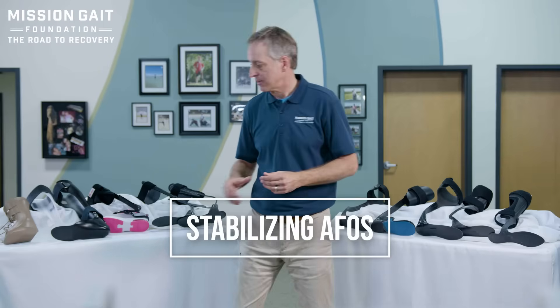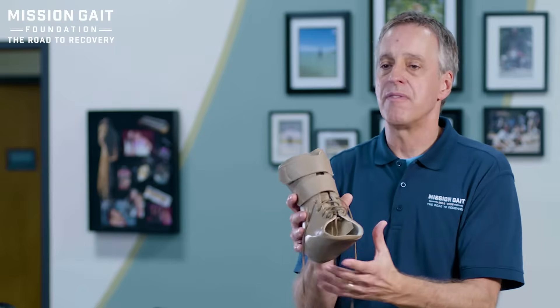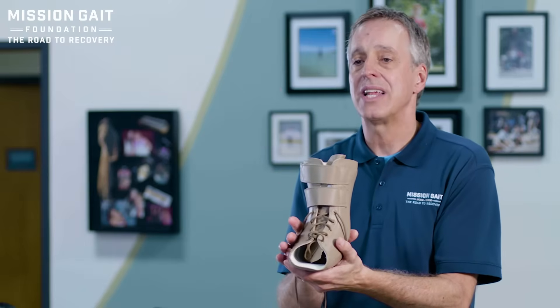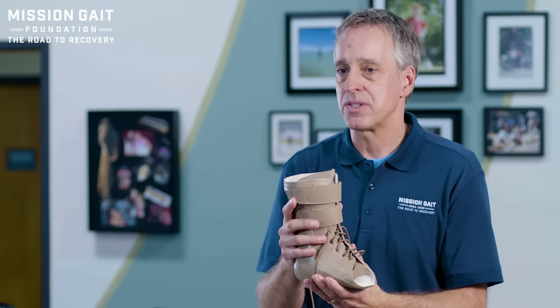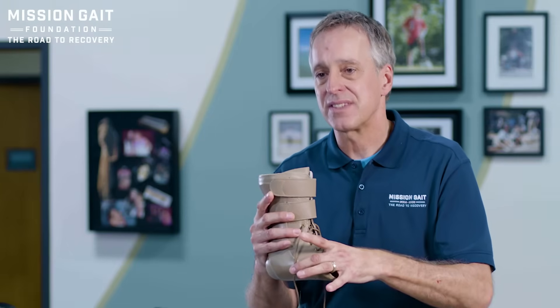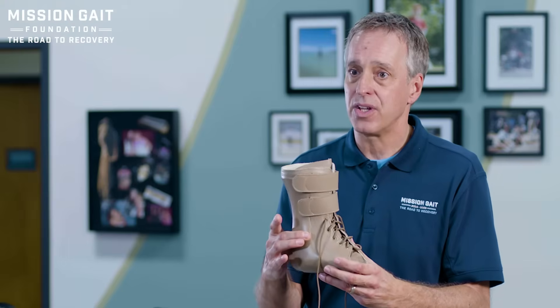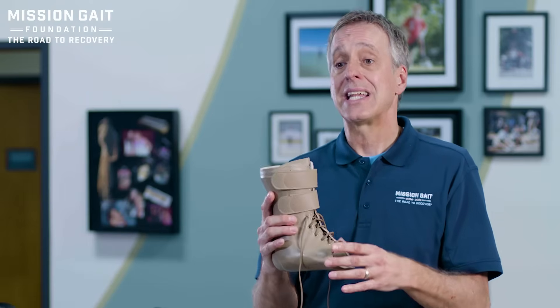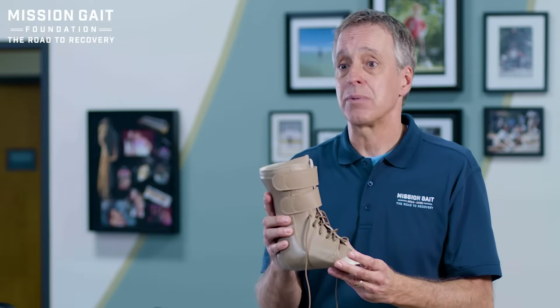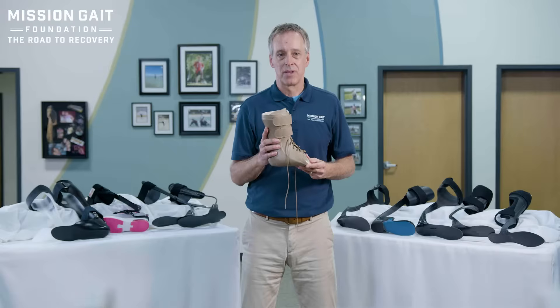Let's start with pure stabilization. A stabilization brace laces up, is very stabilizing, and can also help with alignment — realigning someone's leg and holding it in position. It represents a category of braces with different levels of stiffness and rigidity, all about stabilizing the ankle. If that's what you need, this can be the right brace. But you have to know: is this brace going to get the job done, and can you tolerate its use?